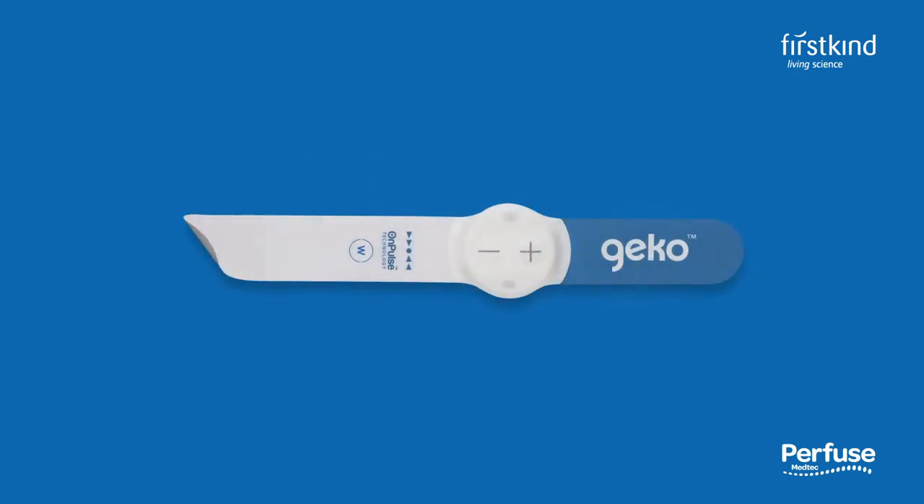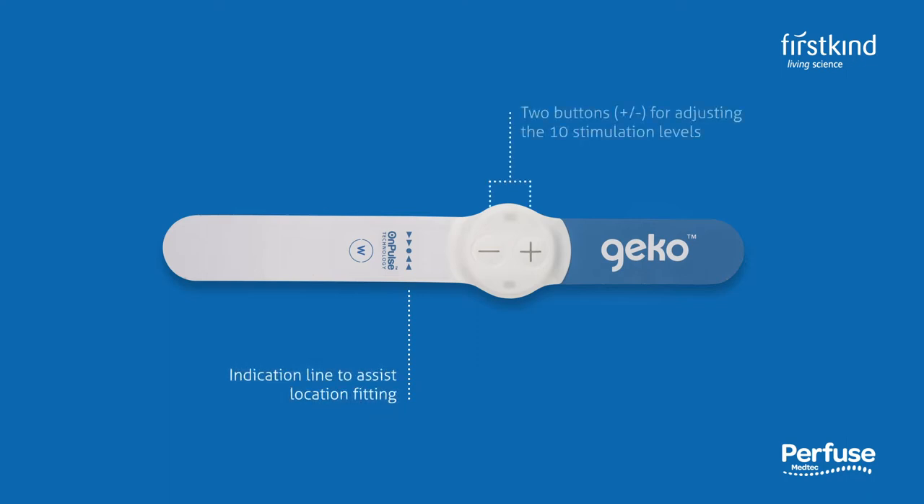The Gecko device is easy to fit and can be applied in just 60 seconds. On the front is a location marker to correctly position the device, plus and minus buttons to switch the device on and off and to change the stimulation levels, and two LED indicator lights.